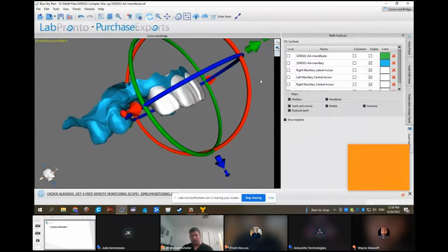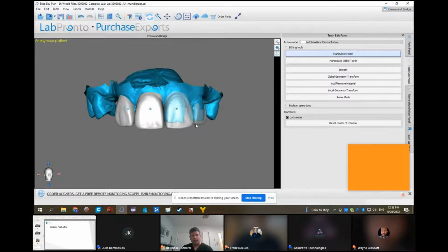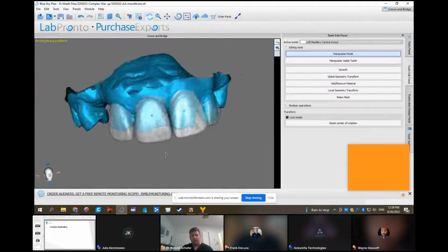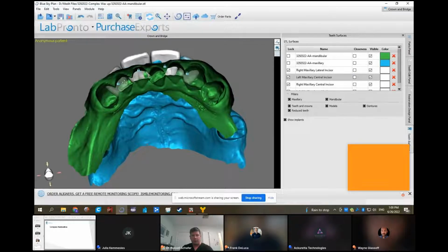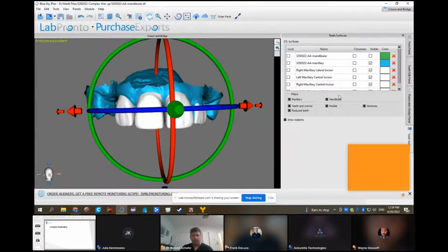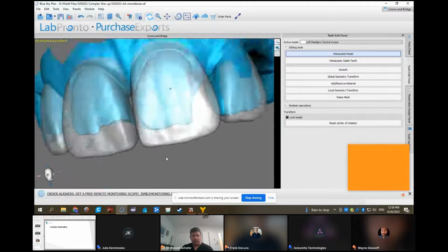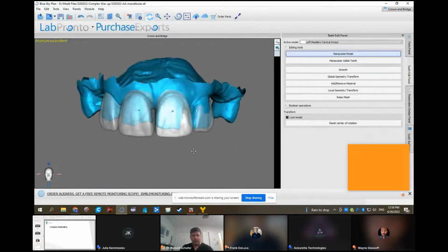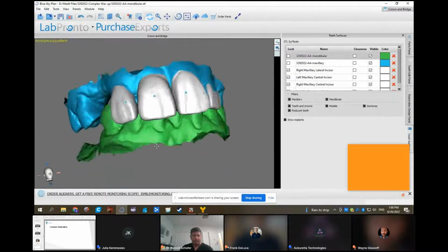In the initial one, I did all of the teeth in the edentulous areas as well to give him an idea of what it would look like with the partials in his mouth. But here I'm just checking the thickness, making sure I have enough room, and seeing what my shells would look like. From there, we just move everything around where I want to, which is always easy to do. Doing translucency so I could see, again, the thickness on it.